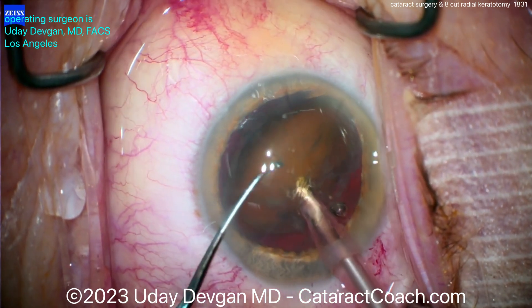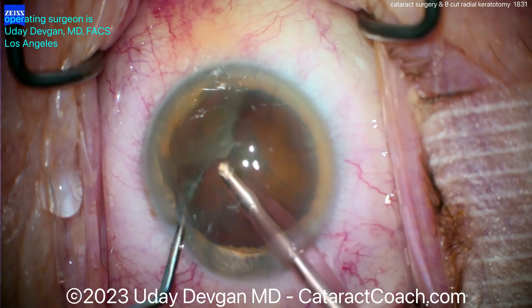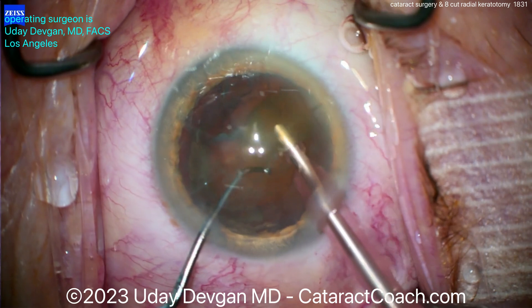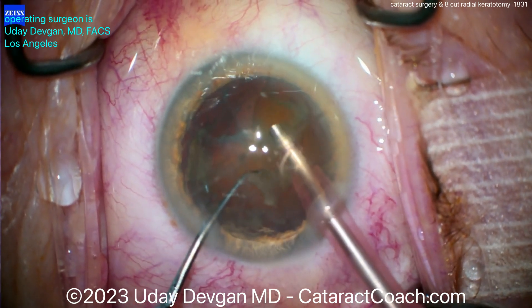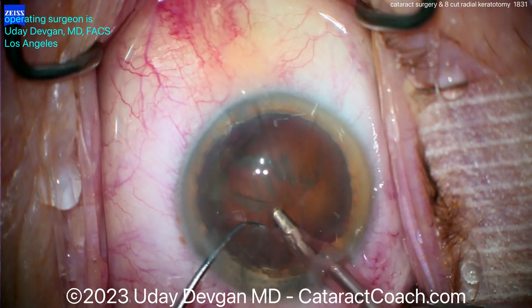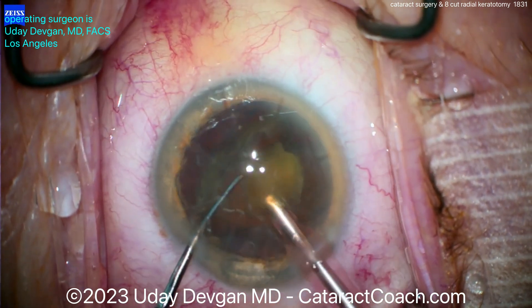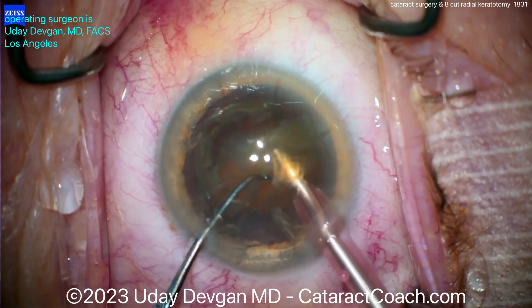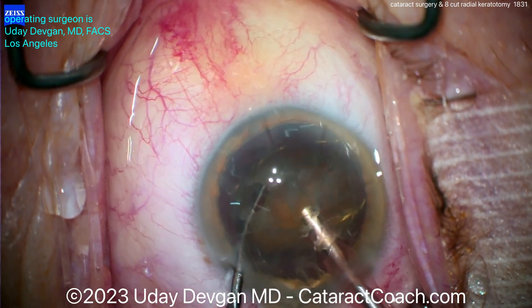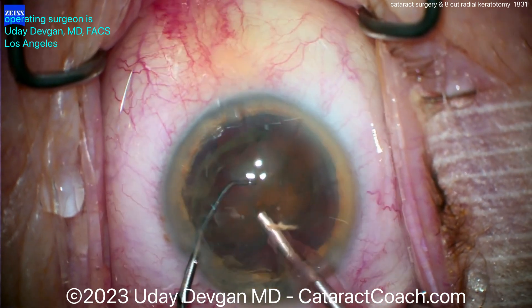There's the nucleus — pretty good nuclear density. Put the phaco probe in, chop it behind. Boom, two halves created. We'll sub-chop this cataract; there's about a quarter that got chopped off. Emulsify that down. As you do this, you want to be very gentle. Don't use very high infusion pressure — you don't want to split open the RK incisions. Those RK incisions are about 90% depth. Think of a cornea as 500 microns: 90% depth means 450 microns cut, leaving only 50 microns uncut — about half the thickness of a strand of hair. So you've got to be very gentle. Now cutting the cataract into small pieces, you can emulsify those pretty easily.